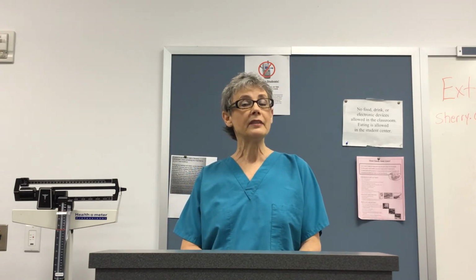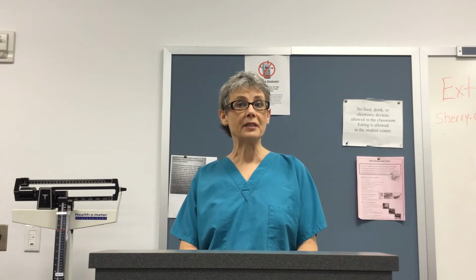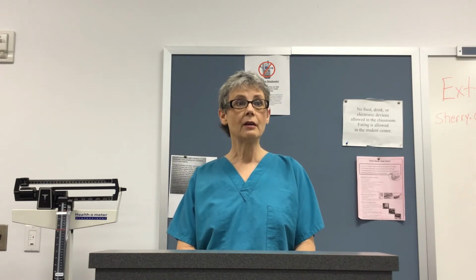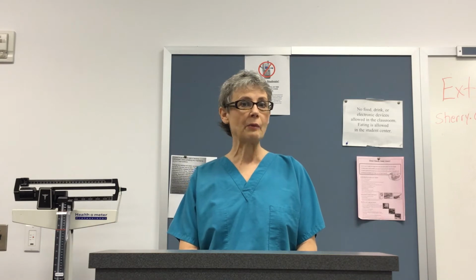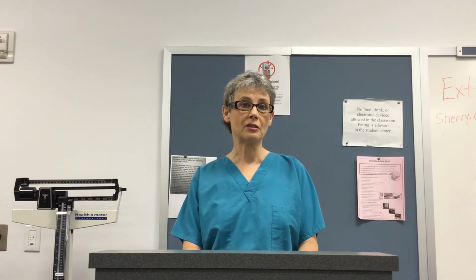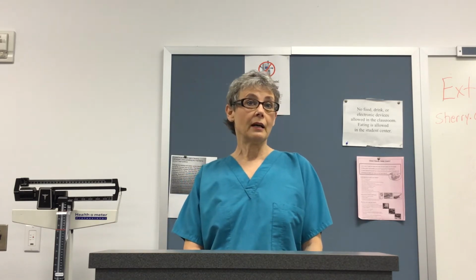Even if this IV site is wrapped in tons of gauze, or maybe even on an IV board, I know it seems like a lot of trouble to unwrap that every 2 hours and take a look, but you must do that. Well, going back to my niece, she had been in the hospital a couple of days and no one had checked that IV site.